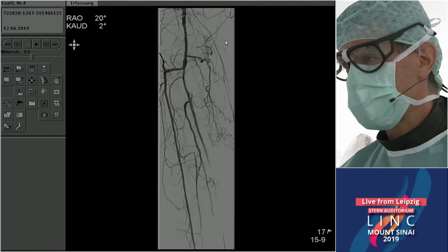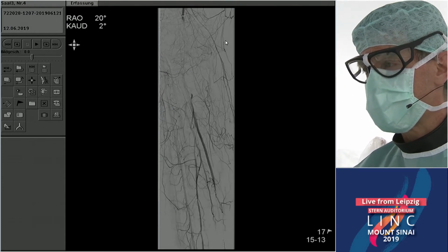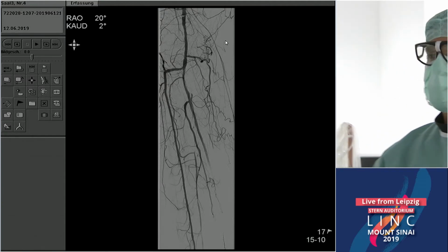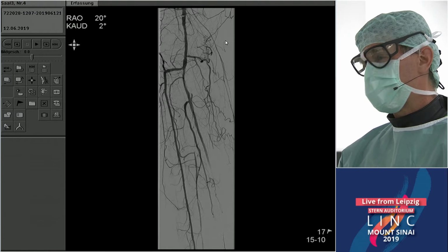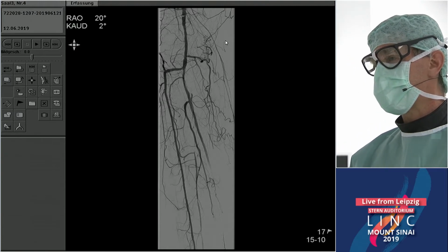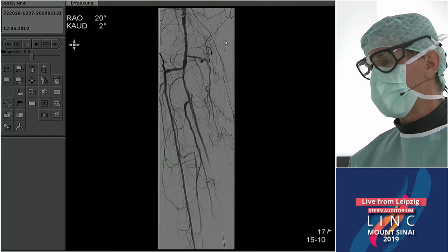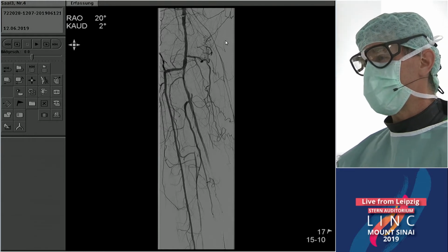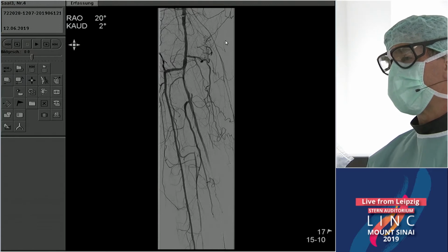Or you see dissections in severely calcified areas, where, of course, the tack does not have that radial force for this kind of lesion. So at the end, we carefully select these dissections, but we decide on an angiographic basis, not with any wire pressure or whatever. I personally don't find it so easy to decide where to tack or where not.